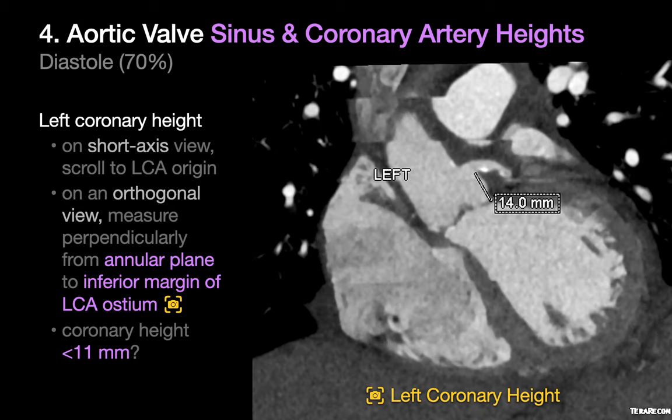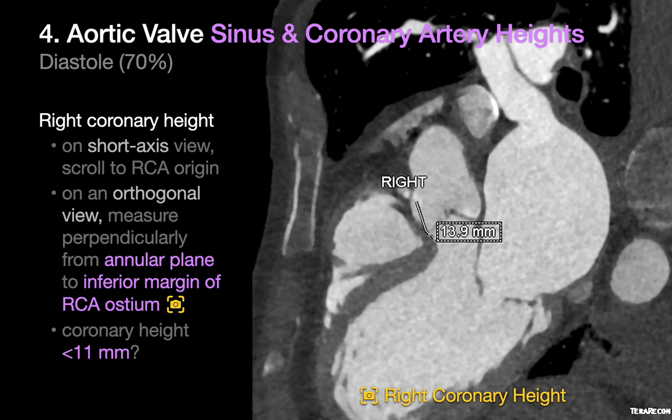Go back to your short axis view and scroll superiorly to the left main coronary artery origin. Go to a long axis view and measure the left coronary height perpendicularly from the aortic annular plane to the inferior margin of the left main coronary artery ostium. Call out coronary height measurements under 11 millimeters since the risk of coronary artery occlusion after TAVR is higher. Do an image capture. Go back to your short axis view and scroll to the right coronary artery origin, then go to a long axis view and measure the right coronary height perpendicularly from the aortic annular plane to the inferior margin of the right coronary artery ostium. Call out measurements under 11 millimeters and do an image capture.